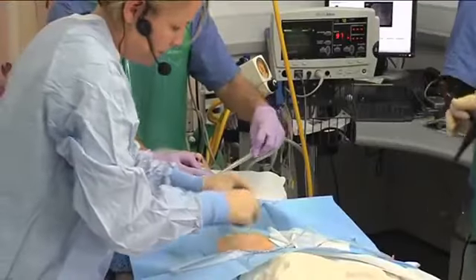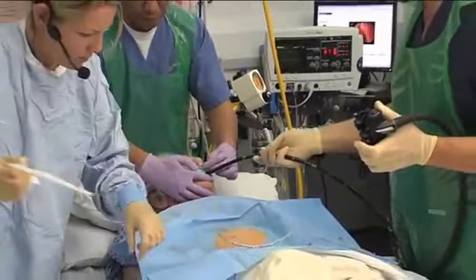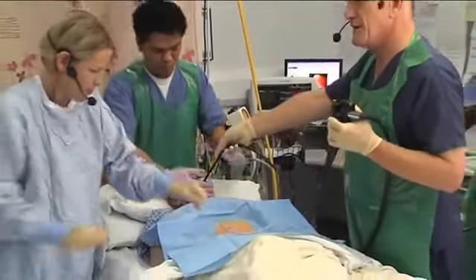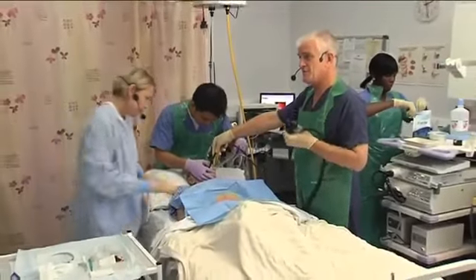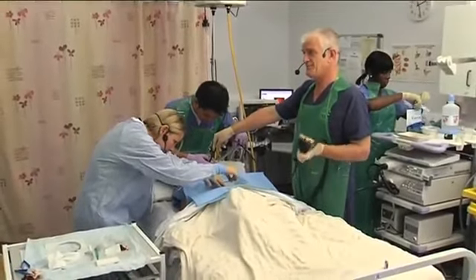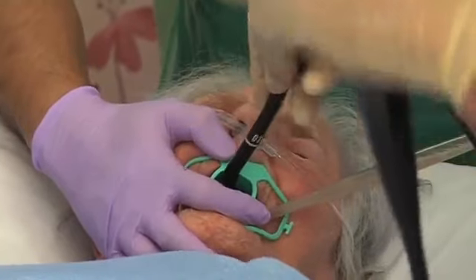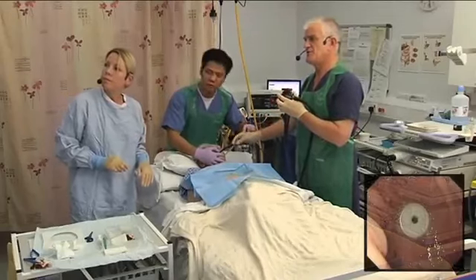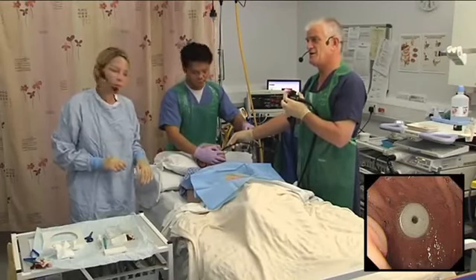And we tend to check the position of our tube because one of the complications is the so-called bumper syndrome, where the tube is too tight, and it's always wise to just check the position. It takes 2 minutes just to check the position of the bumper. There we can see our bumper there. It's not tight, just sitting nicely on the mucosa, which is absolutely fine.